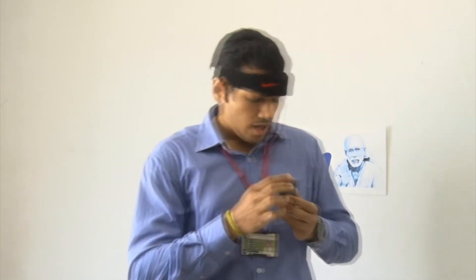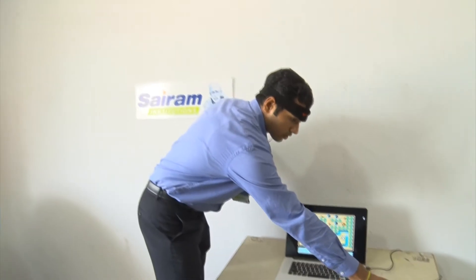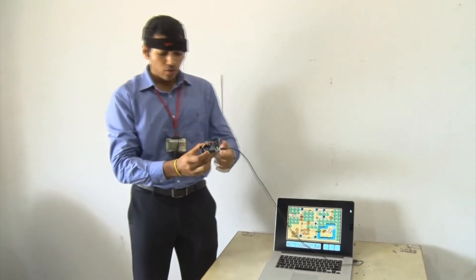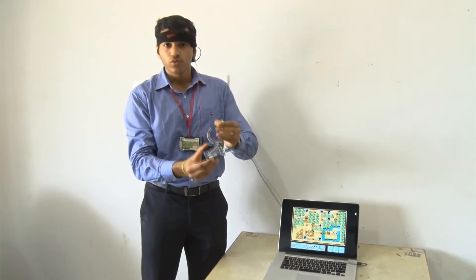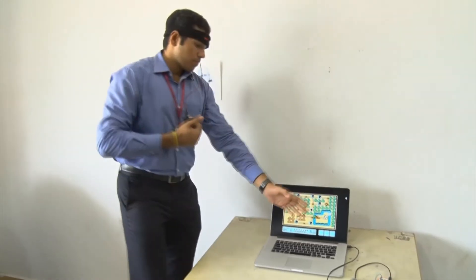And this will be a reference electrode that will be connected to my ear, like so. Here we have the receiver module, which is essentially an Arduino Leonardo board connected to a Bluetooth receiver. That is connected to a laptop which contains the game.